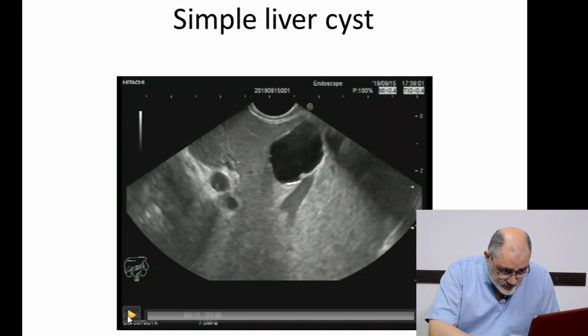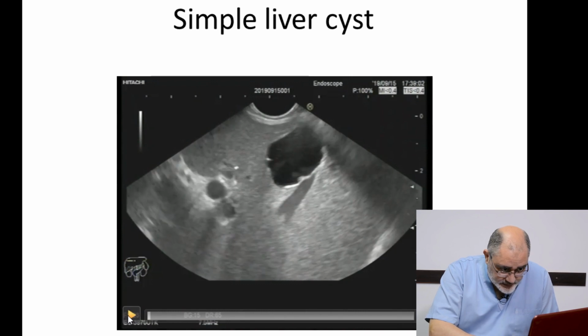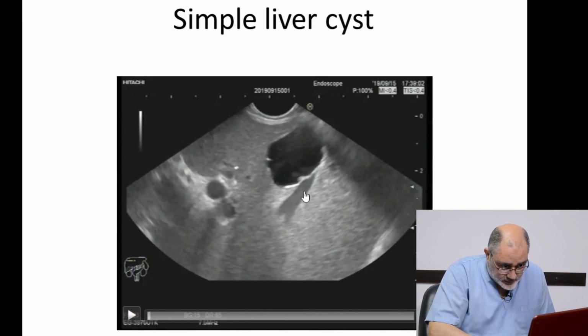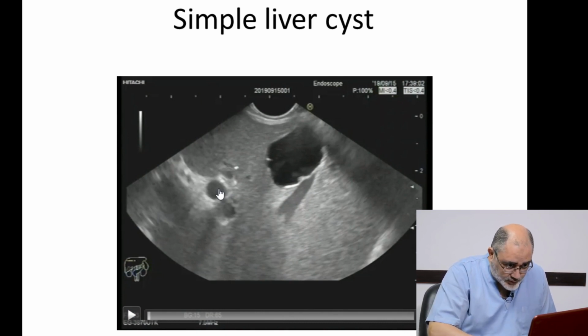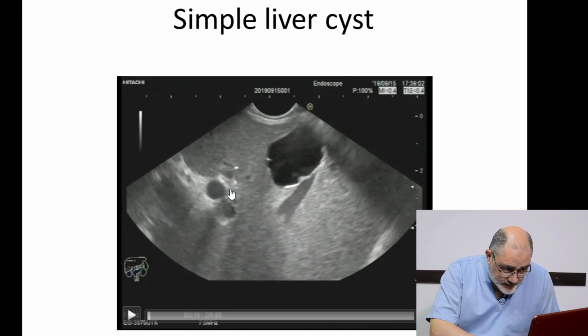Let us see the video. Obviously this is the middle hepatic vein, and this is the left portal vein, the umbilical portion of the left portal vein. So we expect that we will see here the ligamentum venosum, and expect to see here the IVC, and this is the middle hepatic vein going to the IVC. So let us see this video.